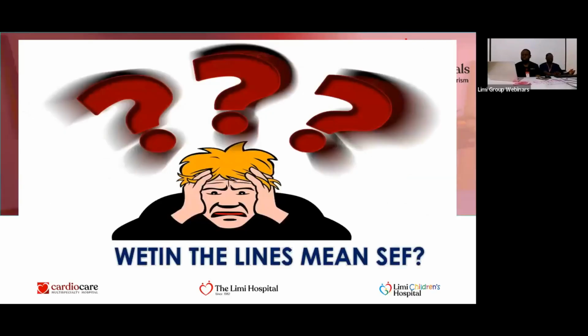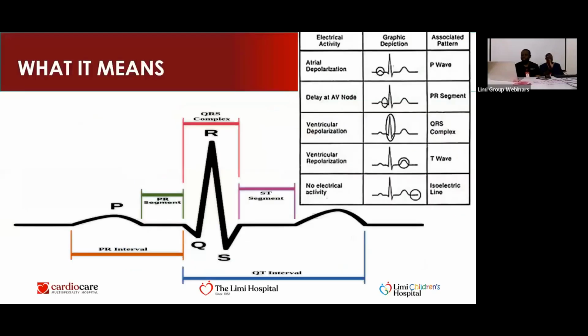For medical doctors and medical students, we all know that on ECG, all you see are different lines and graphs. You need to make sense and meaning of all those lines. So we need to know, this line, what does it stand for? This one that is going up, what does it represent? That is what we'll quickly explain in simple terms.